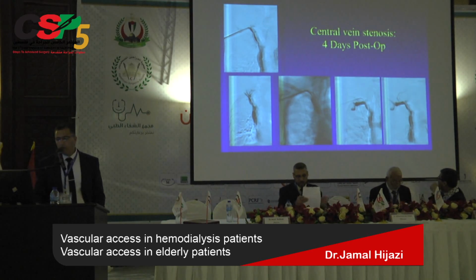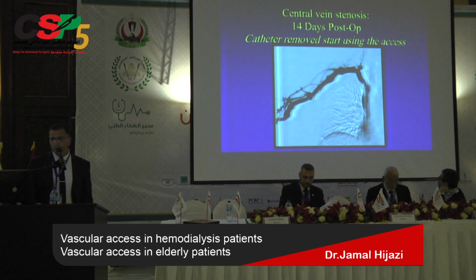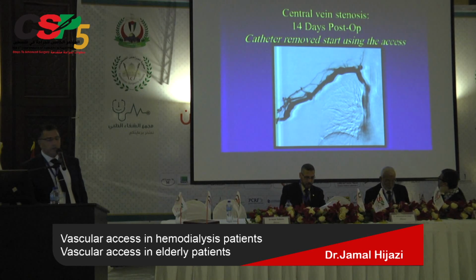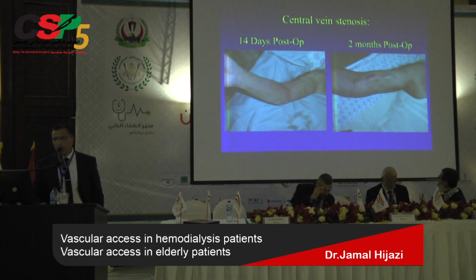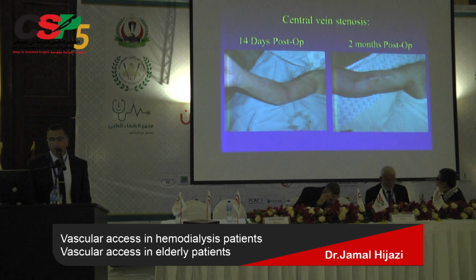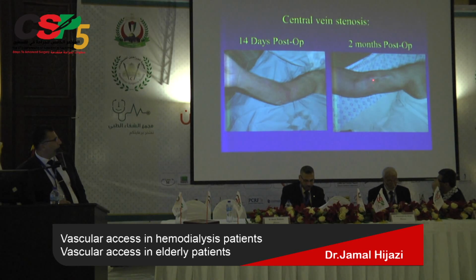We dilated it with a high pressure balloon, and here is the fistula. After 14 days, we removed that catheter, and we can see here 14 days after the surgery that the edema resolved, and 2 months after the surgery, the patient started dialysis via the fistula, with the arterial puncture side and the venous puncture side.